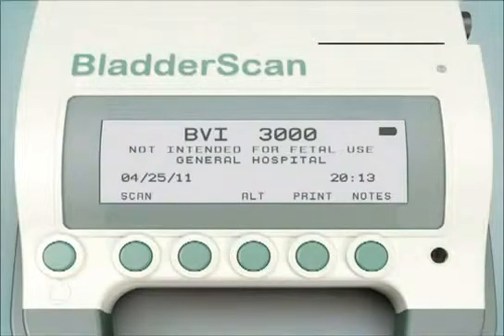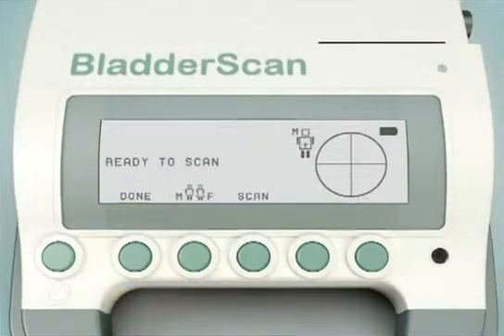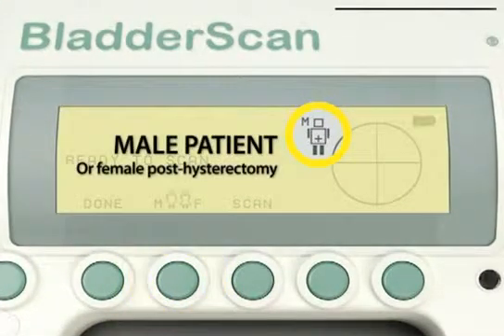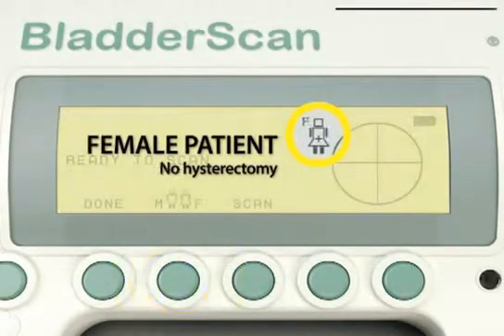To begin, simply press the Scan button. Then press the Gender button to select the appropriate setting. Select to scan a male patient or a female patient who has had a hysterectomy, or select to scan a female patient who has not had a hysterectomy.